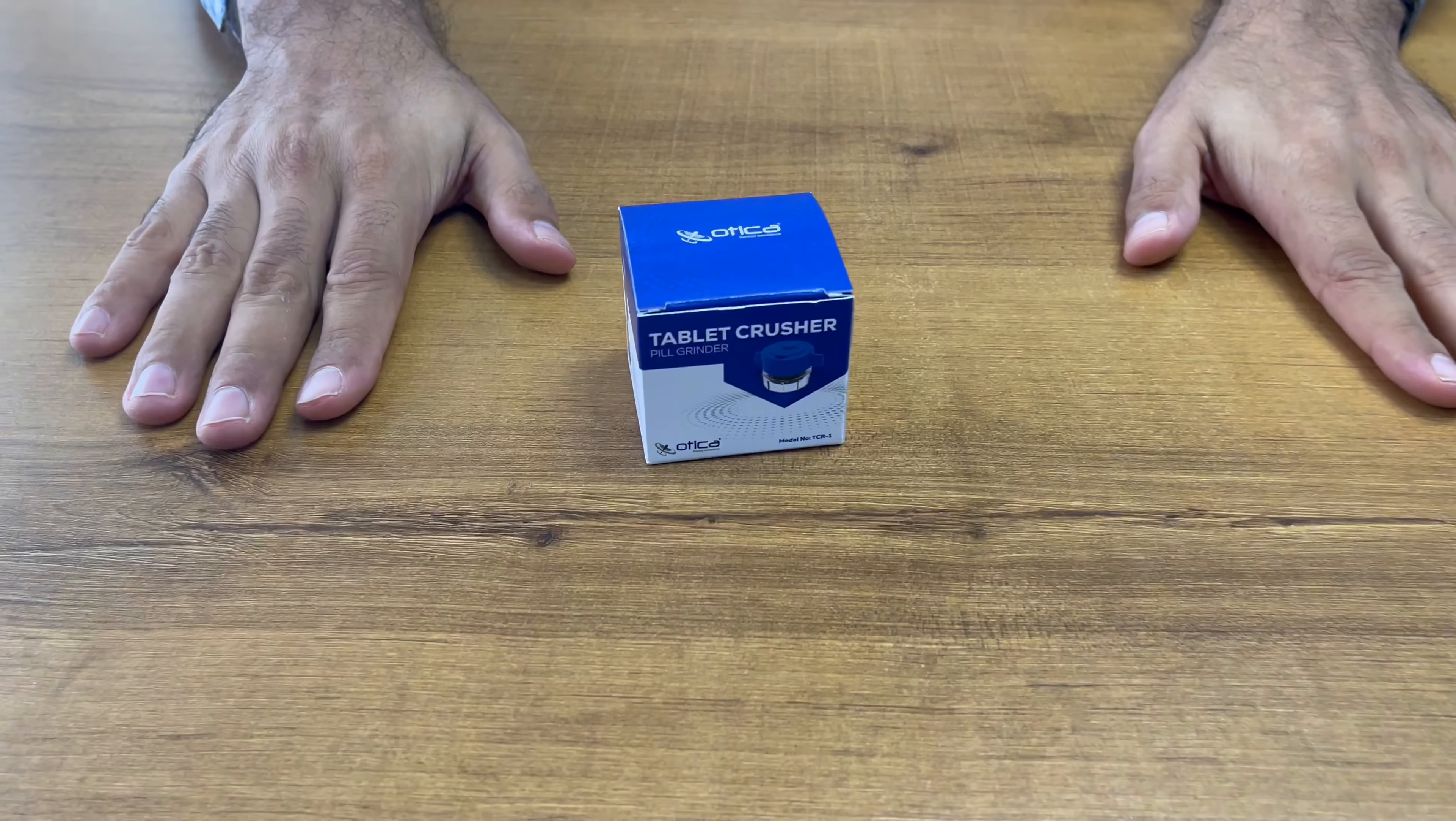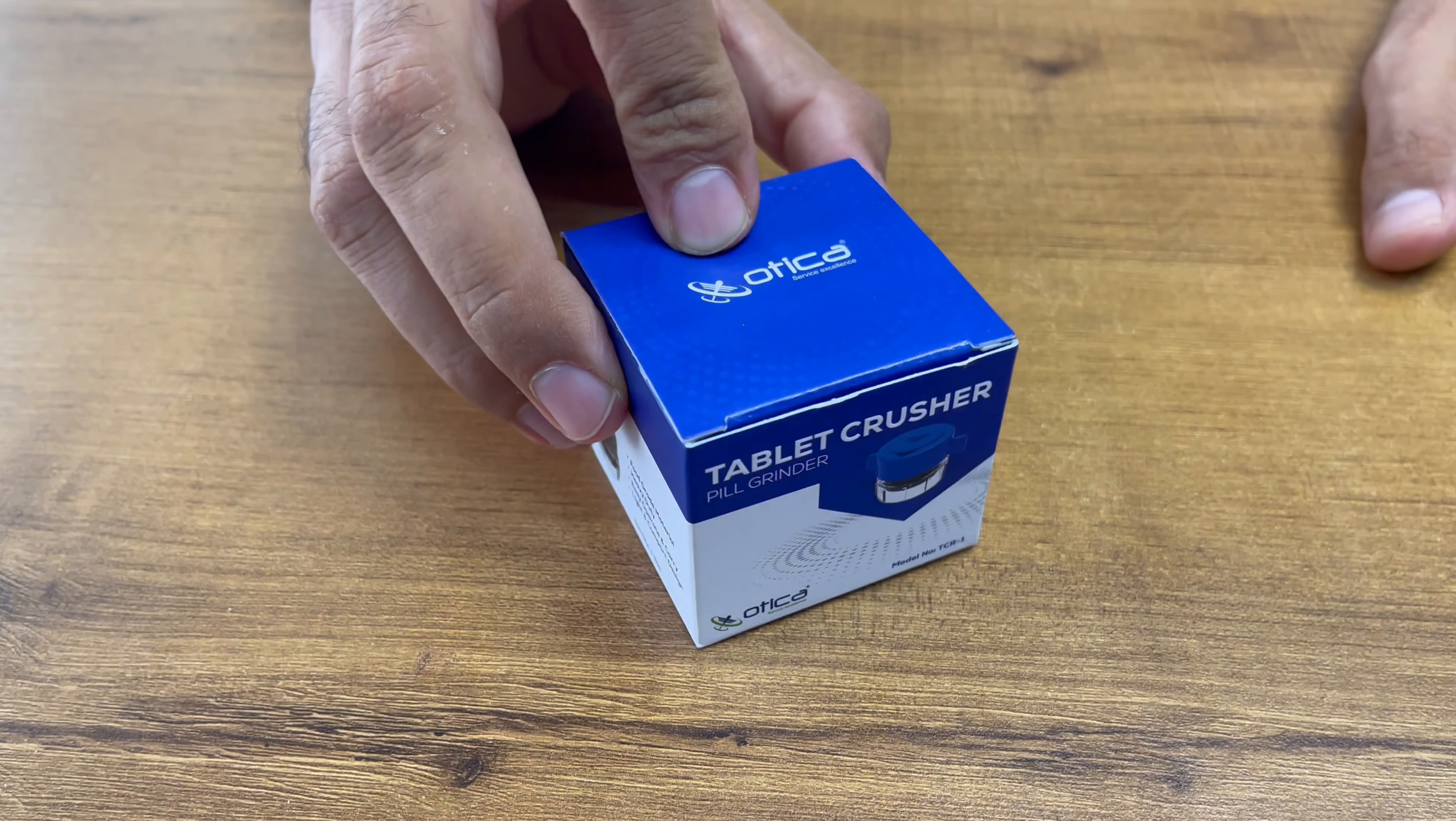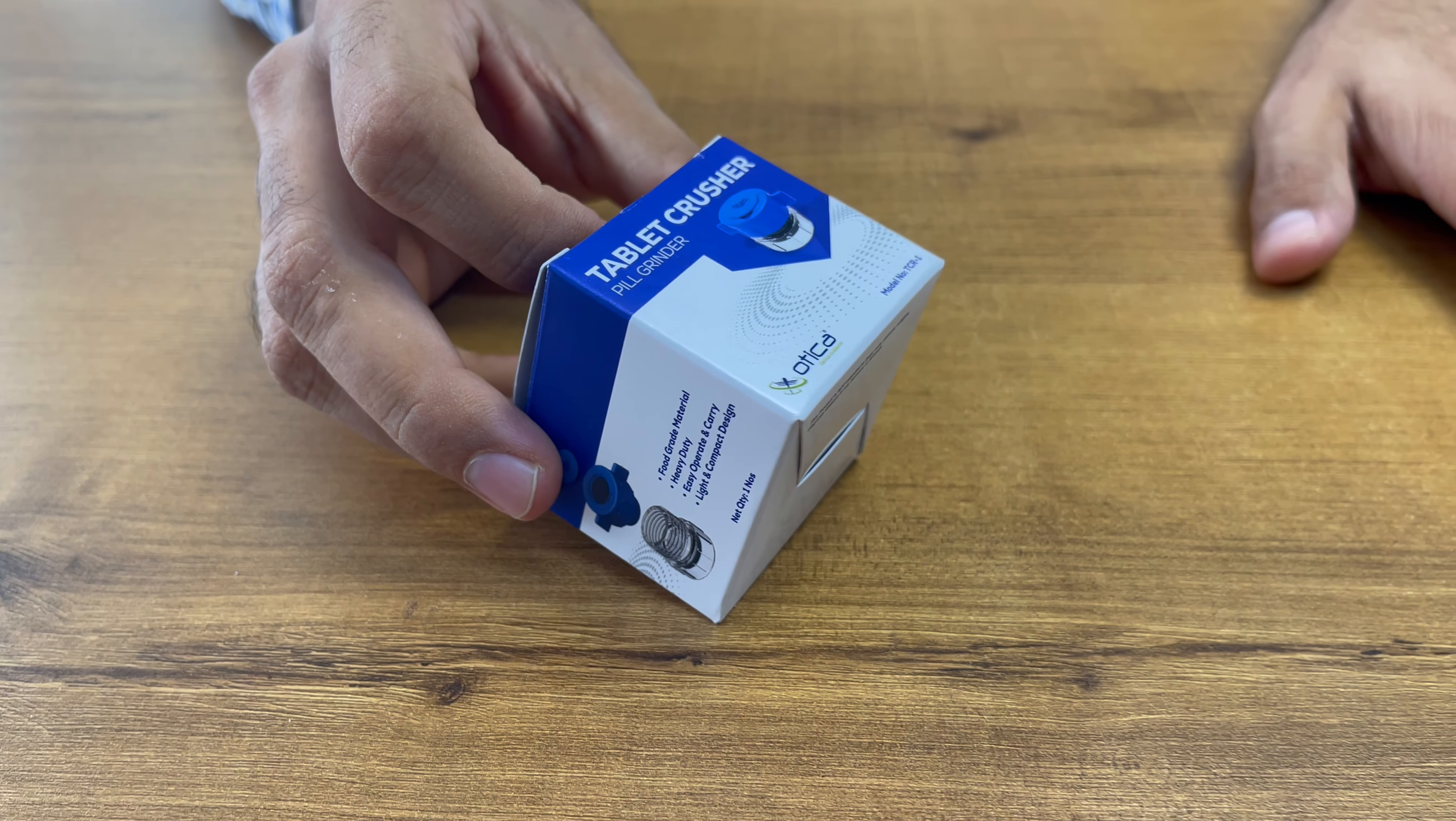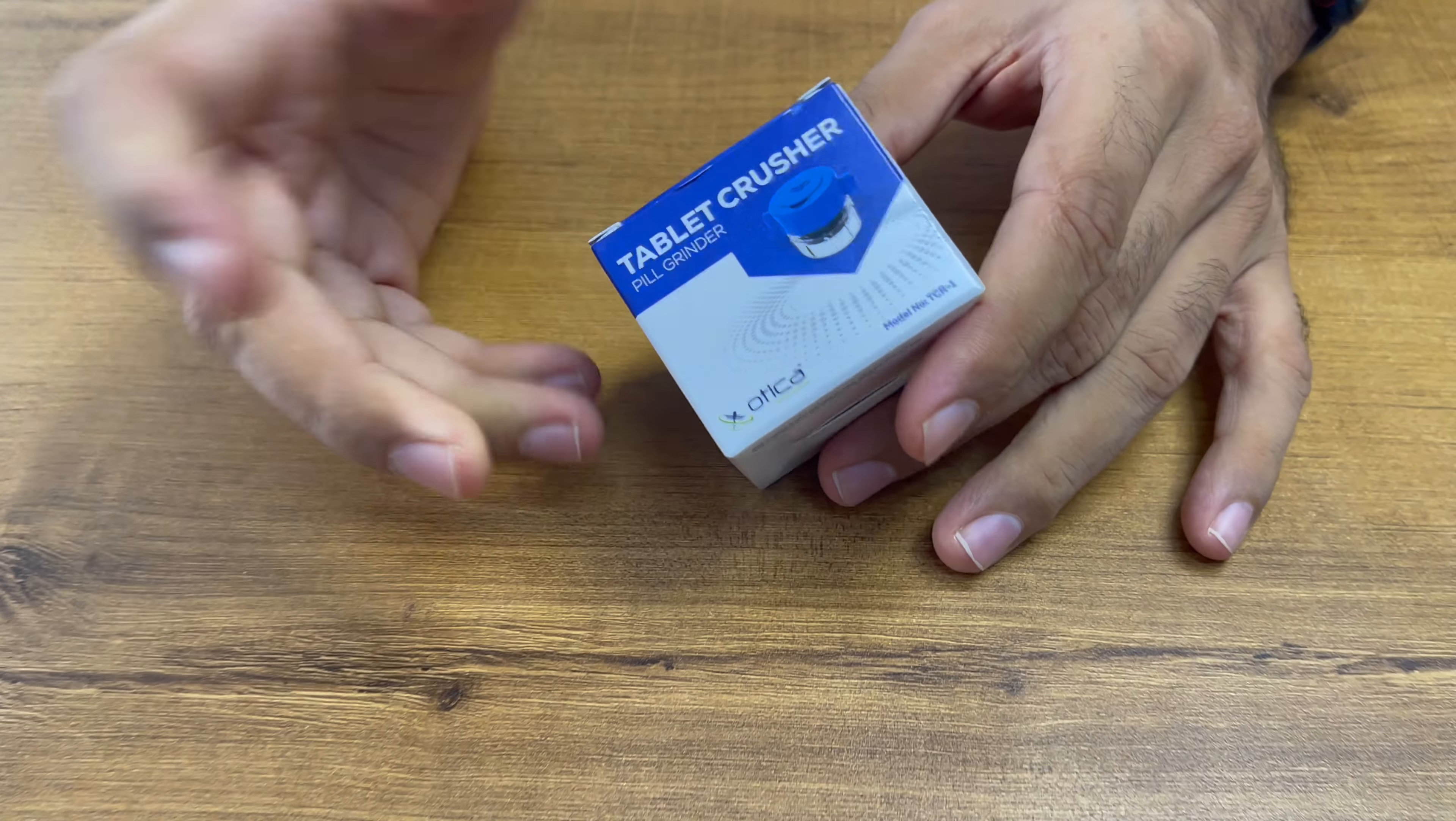Hello friends, welcome to Otika Medithronics Company. Today we are going to demonstrate an unboxing of the Otika tablet crusher, or we can say pill grinder. This device is very useful for old age people who cannot chew the entire tablet, as well as for pediatric patients in the NICU and ICU.